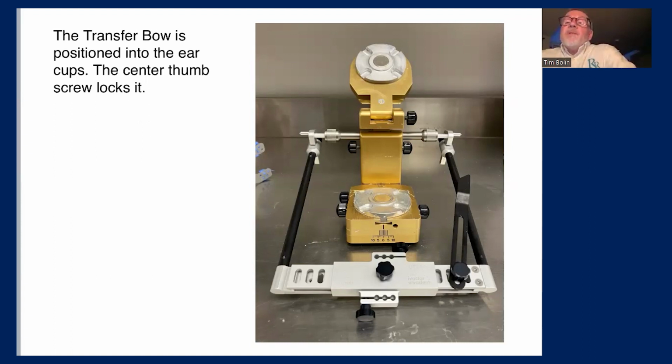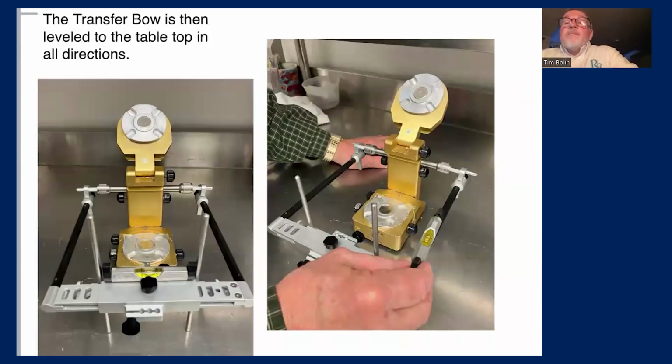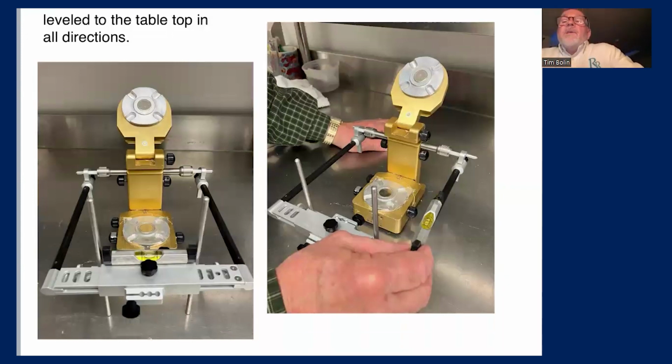Then we level up the transfer bow in all directions. This shows a bubble level. You can see the two upright components in the slide on the left. It's an accessory available through Ivoclar for the transfer bow, and they are exactly for this scenario where we need to level this up on a different articulator other than their system. So we're going to level it up right to left and from front to back. And of course, we're making sure that we're doing this on a level countertop.